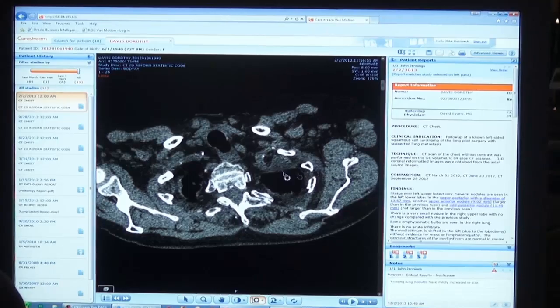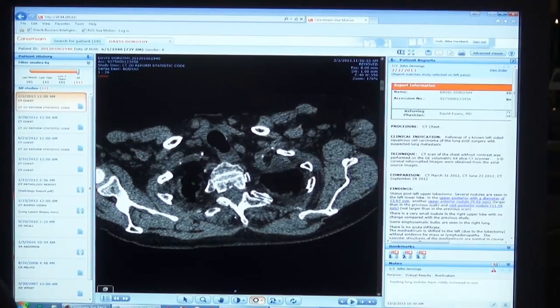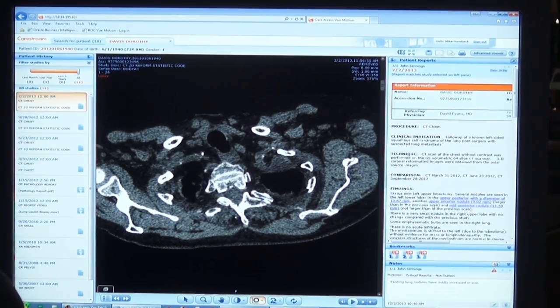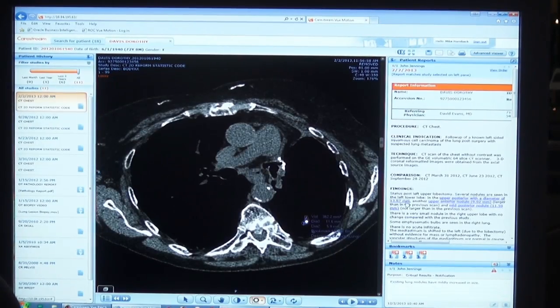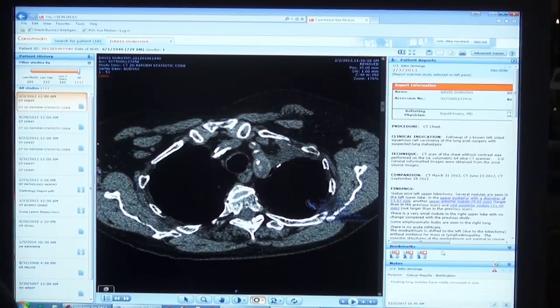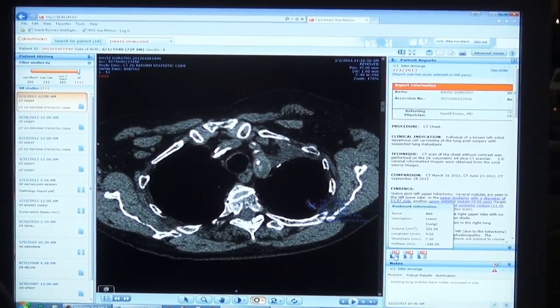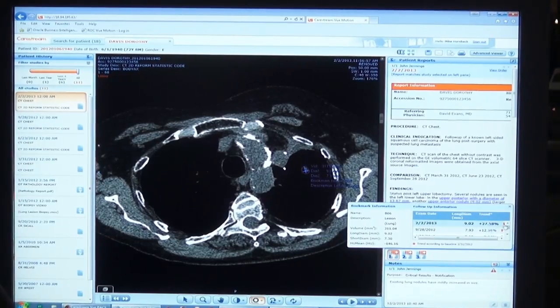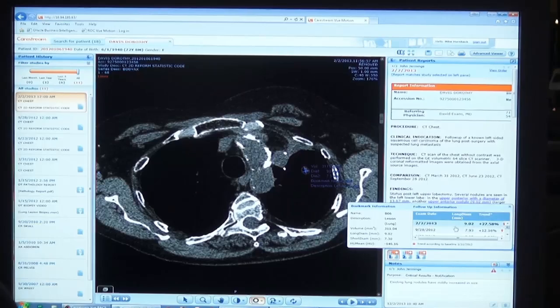A new addition to ViewMotion is that within the reports we now have bookmarks, which were created by the radiologist when reporting in ViewPACS. These bookmarks are active hyperlinks that take me to that exact location in the study I'm viewing for this report. In addition, we have the bookmark table that was also created by the radiologist in ViewPACS. When I open this up, I can see any bookmarks that were created for not only the current study, but also priors.